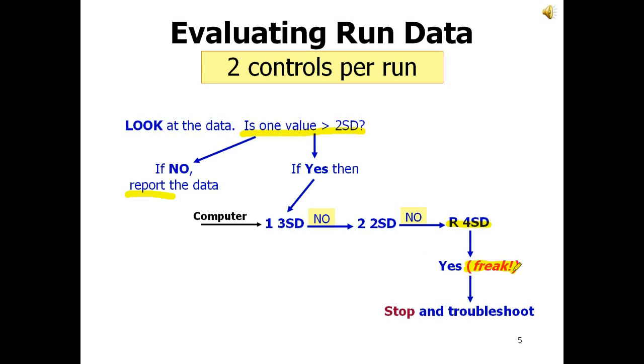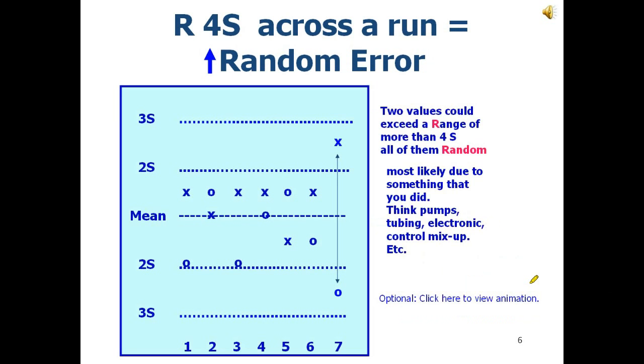The R4S rule is not a rule that Jim Westgard really likes today. As I said, he was using an ACA. But let me show you a picture of the next slide where you do have a picture of the R4S. Now, based on your own SDs and CVs, they are not zero.